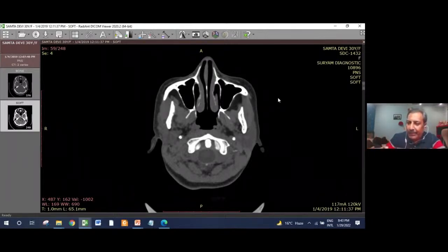The MRI, by means of its different sequences, by means of contrast, T1, T2, diffusion, and so many other sequences, you can characterize the soft tissue much better, and what kind of pathology it could be. Whether it is a fluid, whether it is a hyperintense mucosa, whether it is a necrosed tissue, whether it is a benign tumor, whether it is a vascular tumor, whether it is a malignant tumor, whether there is high intracranial pressure. So many things you can get from the MRI.